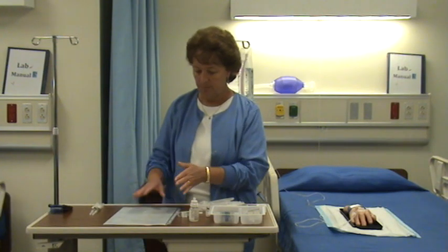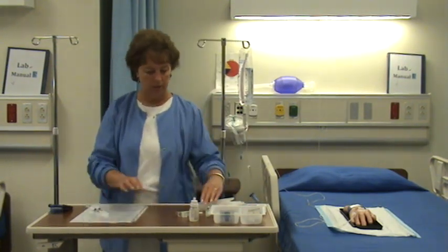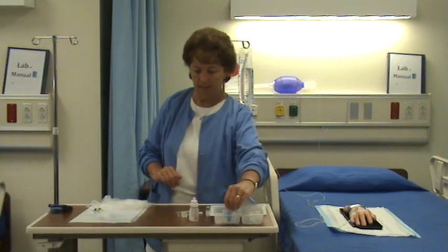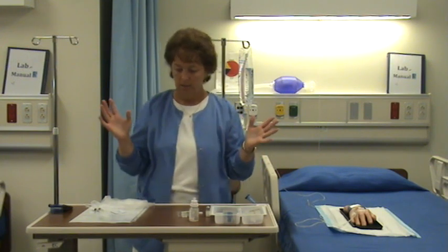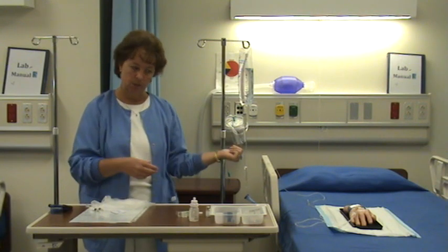So I'm doing this in the med room, and then I'm going to get ready to go into the patient's room. I've got my drug, my flush. I'm going to need some gloves, and an alcohol swab, and make sure that I've got my watch. Come into the room, and I've done 2 checks already on my Lasix, so I'm going to do my 3rd check when I come in.